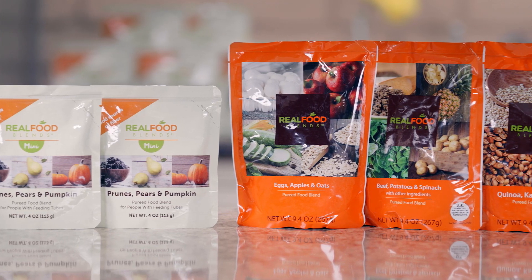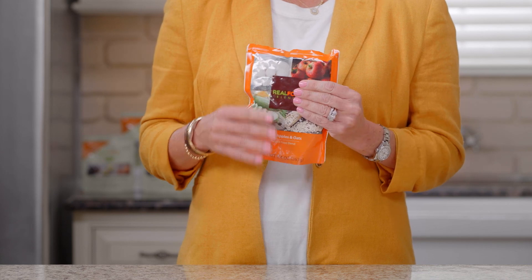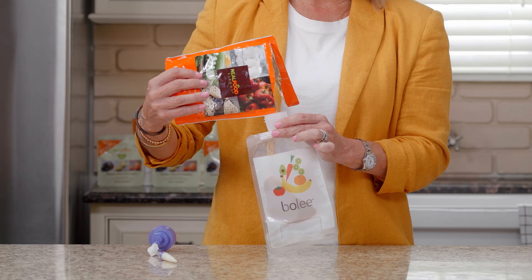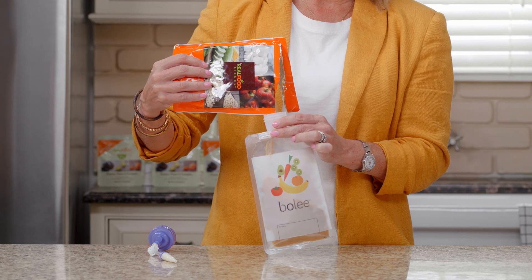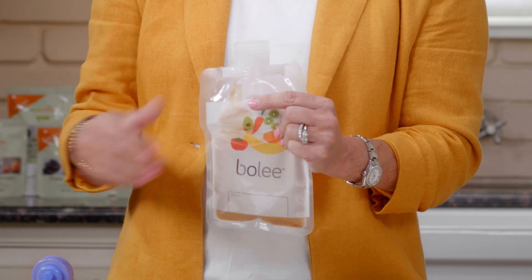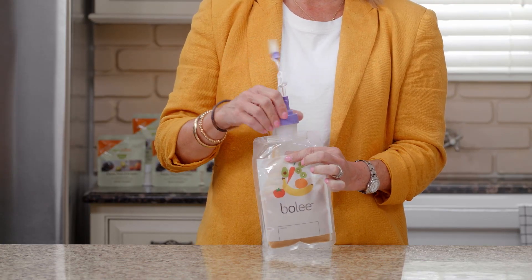When administering real food blends, you want to knead the pouch because it is food. With the reusable Boley bag system, you will clamp the Bolink large cap, pour the amount needed into the Boley bag, then knead the bag to evenly distribute. Attach the Bolink large cap to the Boley bag.